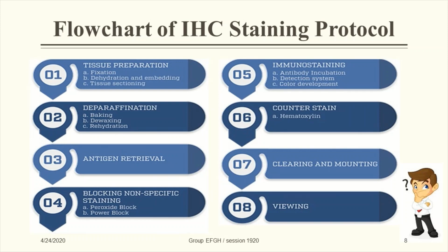The upcoming step is counterstain, to provide contrast to the primary stain. One of the common gold standard stains that we use in the lab is hematoxylin and eosin staining. Finally, after mounting the specimen onto the glass slide, the slide is ready to be viewed.